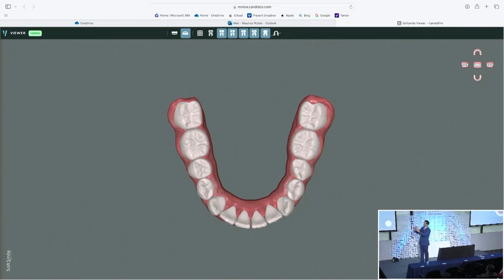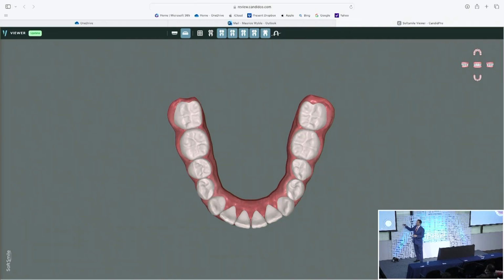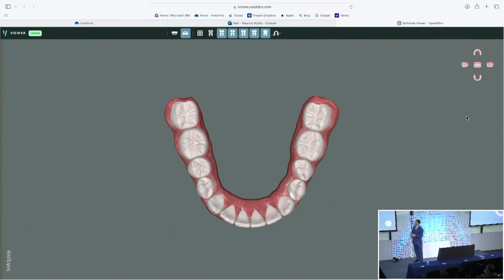And then the same thing. We're seeing the back teeth get a little wider. And basically, you're going to go original to final, just to do a little snap of the before and after to see the bigger jump. Nice. But let's go back to the upper arch.